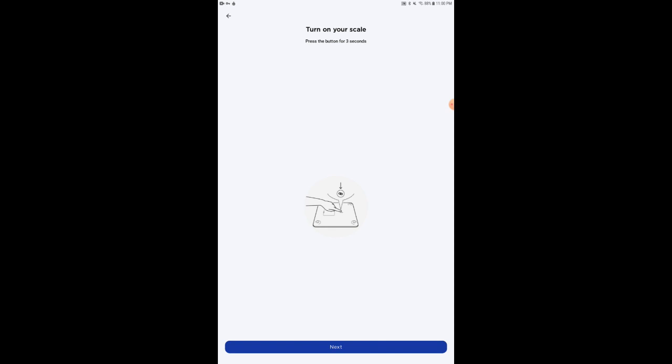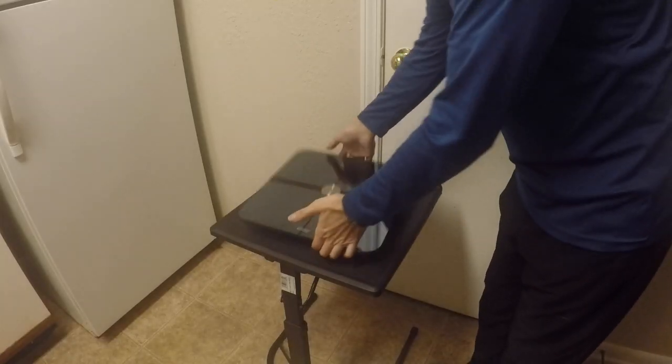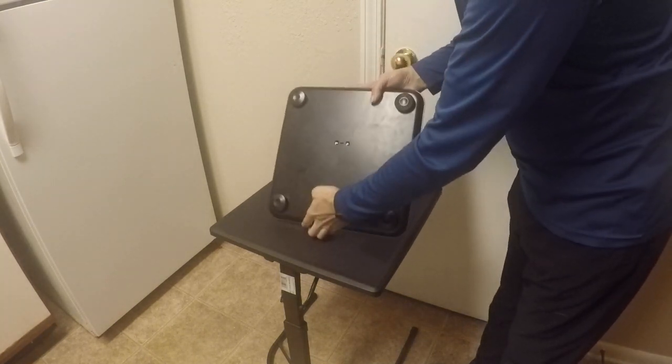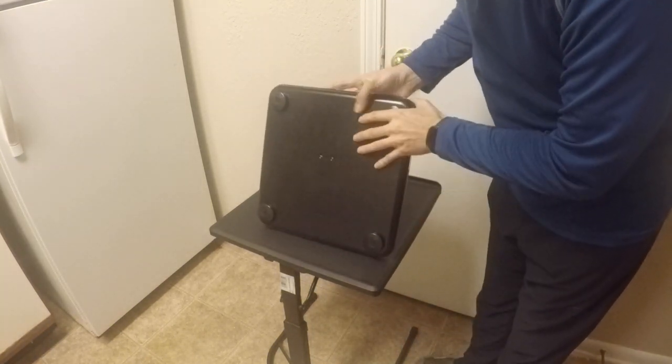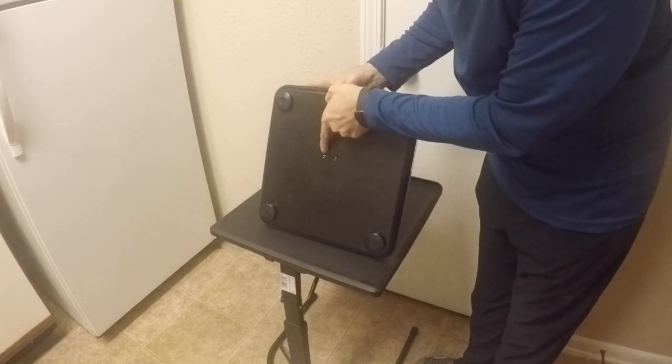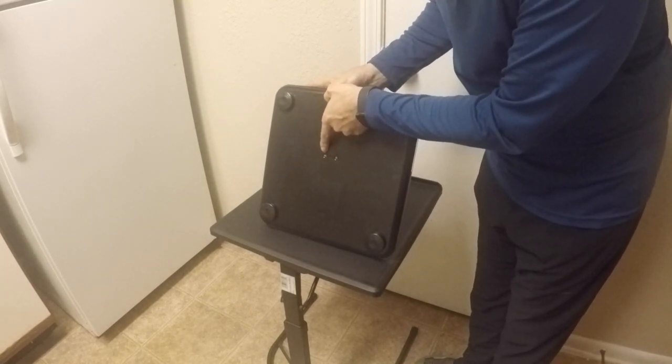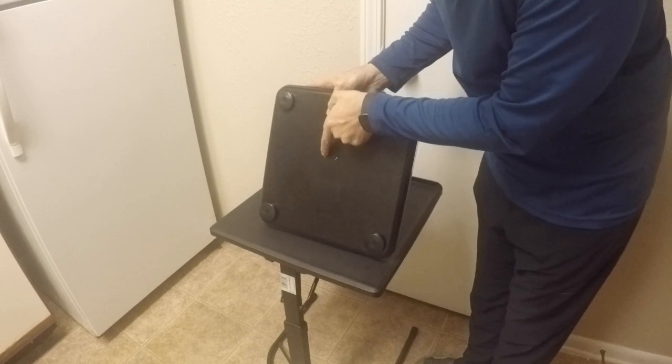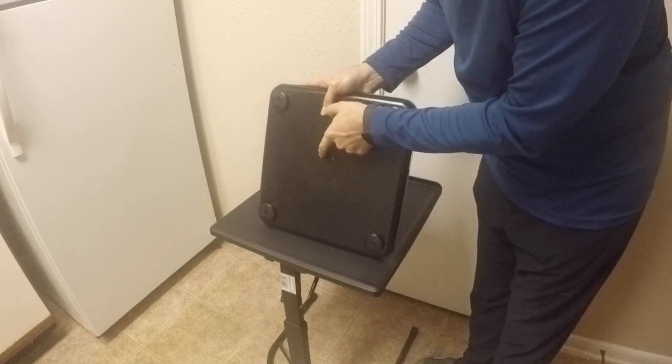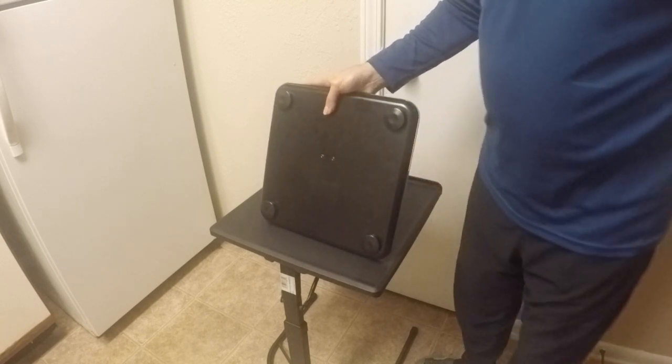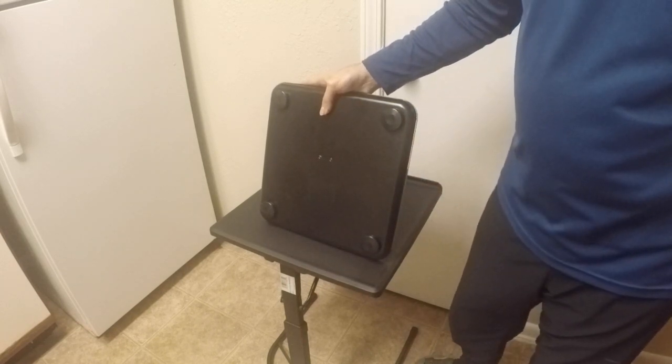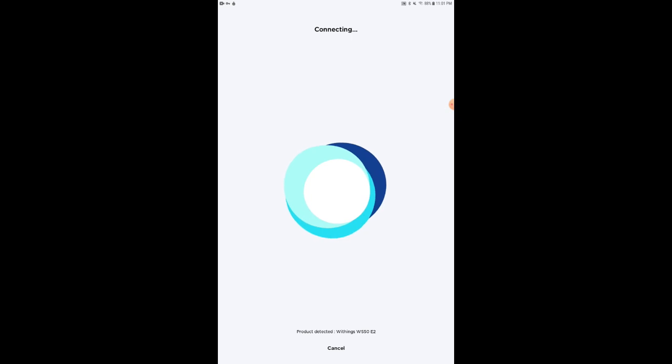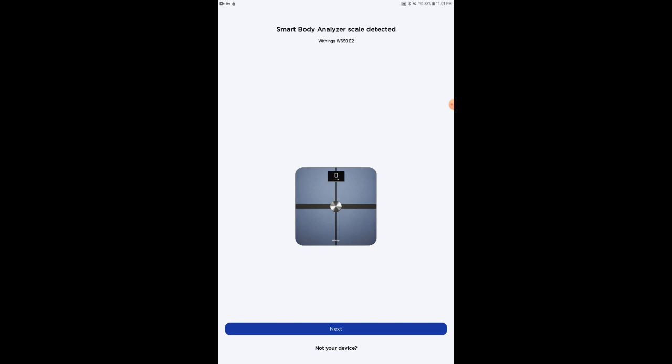And here's where I have to go back to the scale. The scale backwards, and you can see here, the button to link them is this one that I'm pointing at right now. And I have to do it for three seconds. One, two, three. I'm going to let it go and hit Next on the phone here. And it's connecting—product detected, Withings WS and so forth. And it's telling me that the scale was detected here. Hit Next.